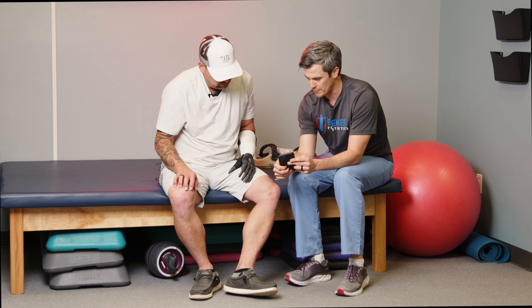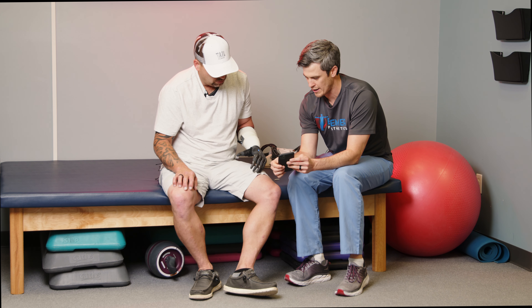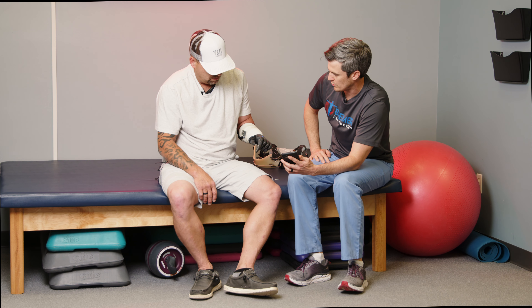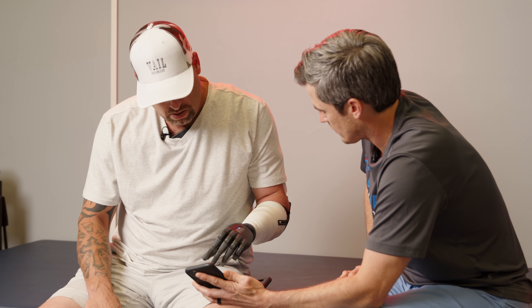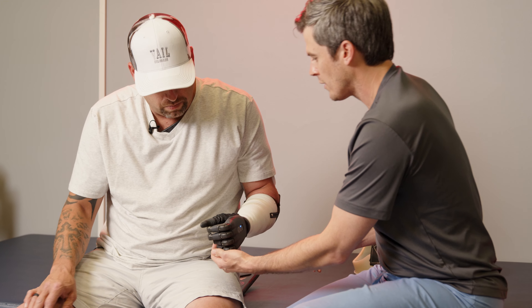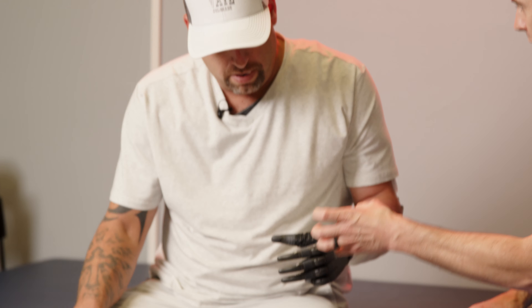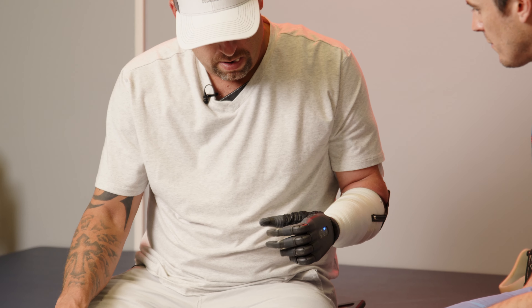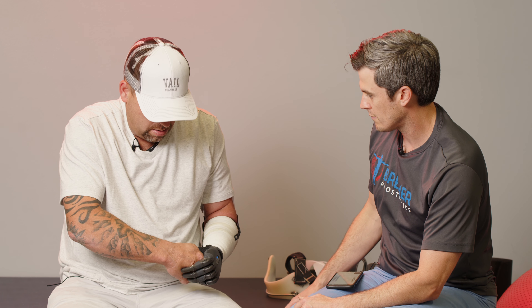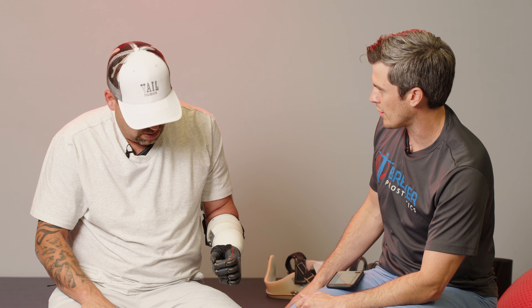So like, if you want to see what something is, you go to the pointer, you say view and it shows you what pointer is. And you can go to try and it'll change it to that. Now watch when you move it. This one is like — see how the pinky's staying down — if you want to grip something that's spherical, or if you're holding like a can of pop or a beer or something like that. It's got the grip stop feature on it and stuff.